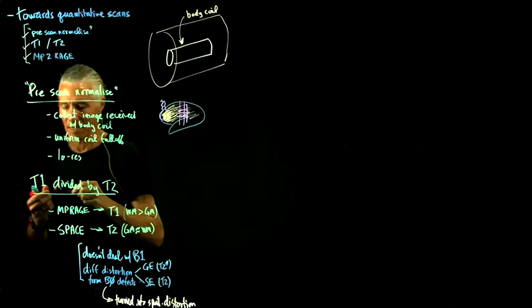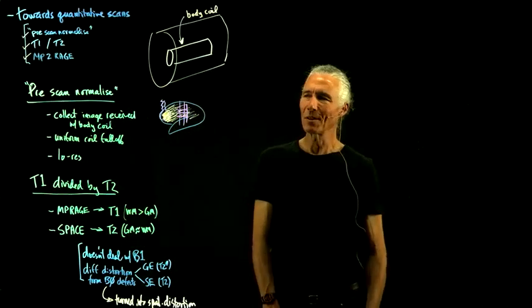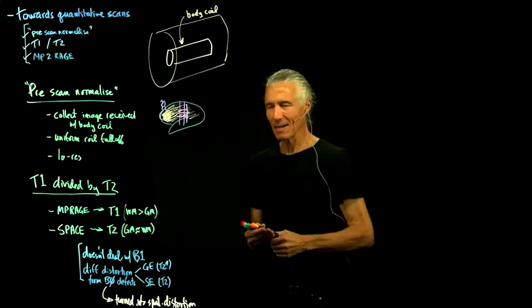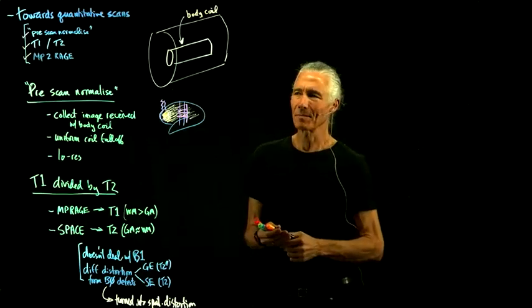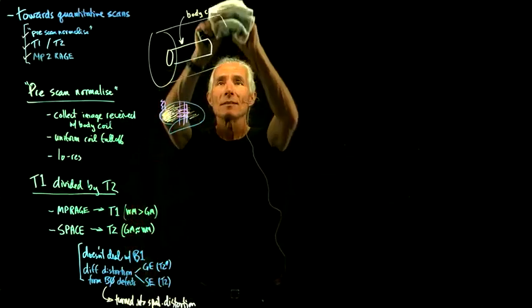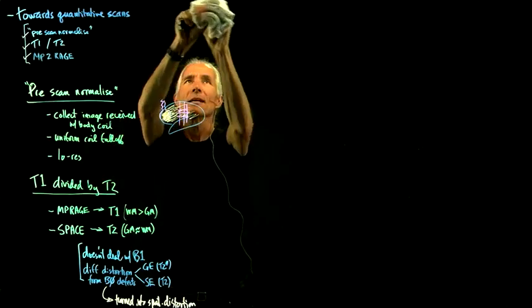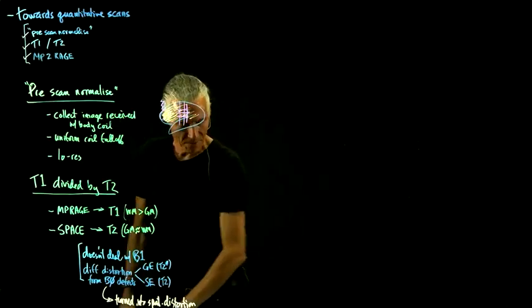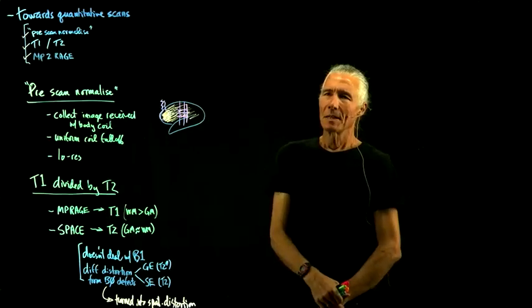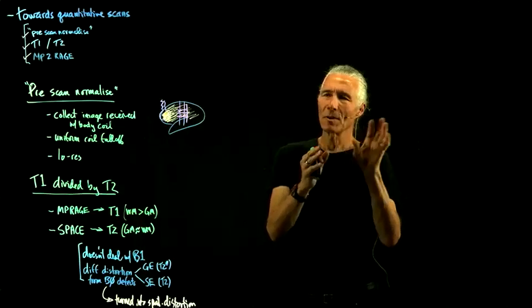And then the last one, or we could just collect two scans all at once, and that's MP2RAGE. So a couple times ago, we talked about how MPRAGE works. It was this gradient echo sequence, kind of a weird sequence where you had this inversion pulse, and then you do a FLASH type scan.